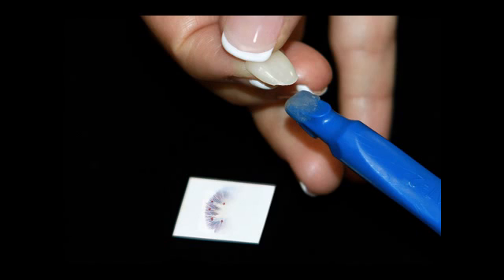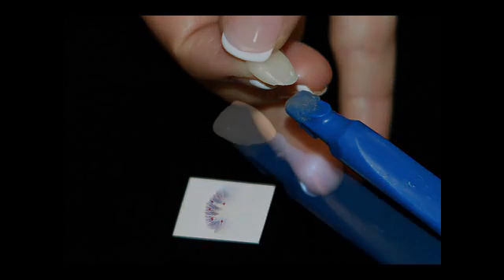Using either the AT1 or AT2 tool, affix a small amount of white utility wax at the tip and place the restoration.